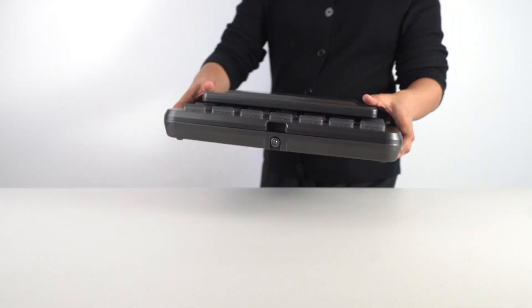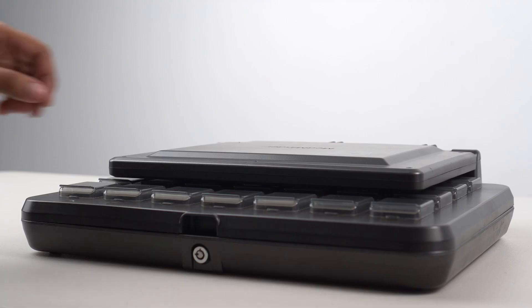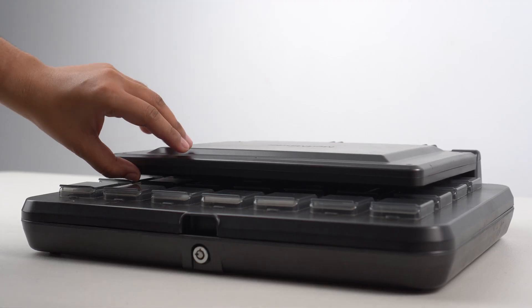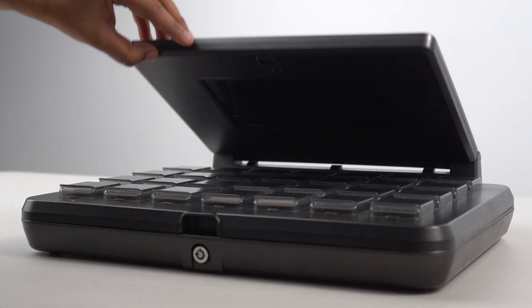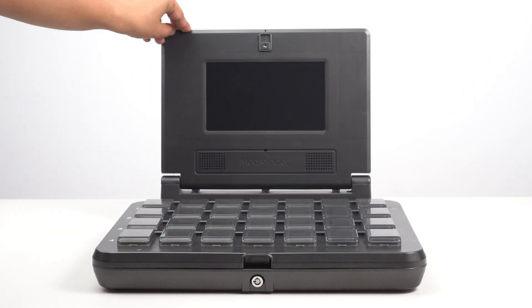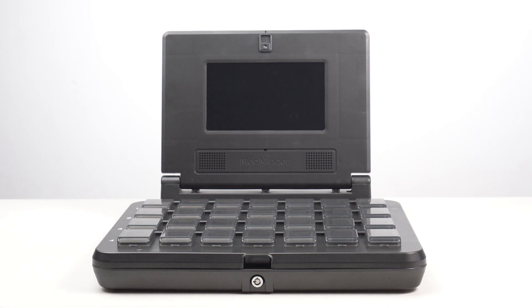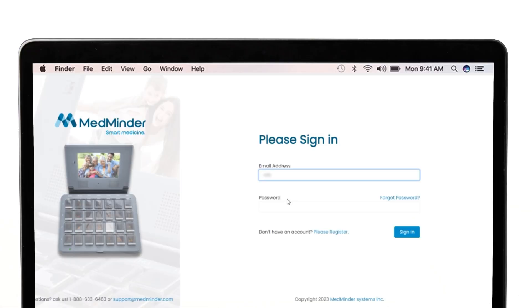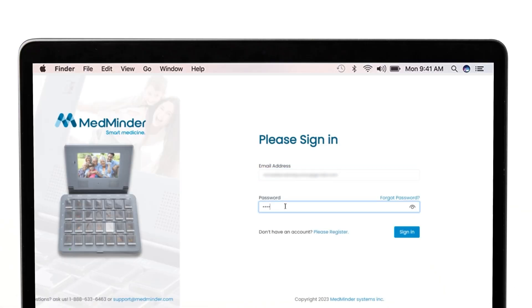Welcome to MedMinder. In this video, we will guide you through the steps to lock and unlock your MedMinder device. First, open your web browser and go to the MedMinder portal. Log in with your username and password.